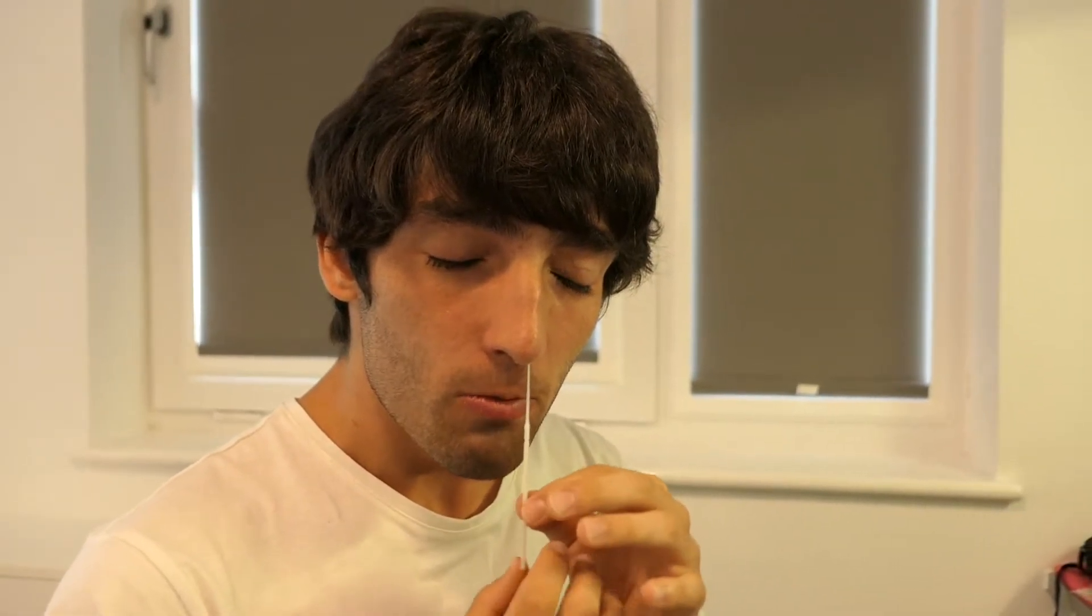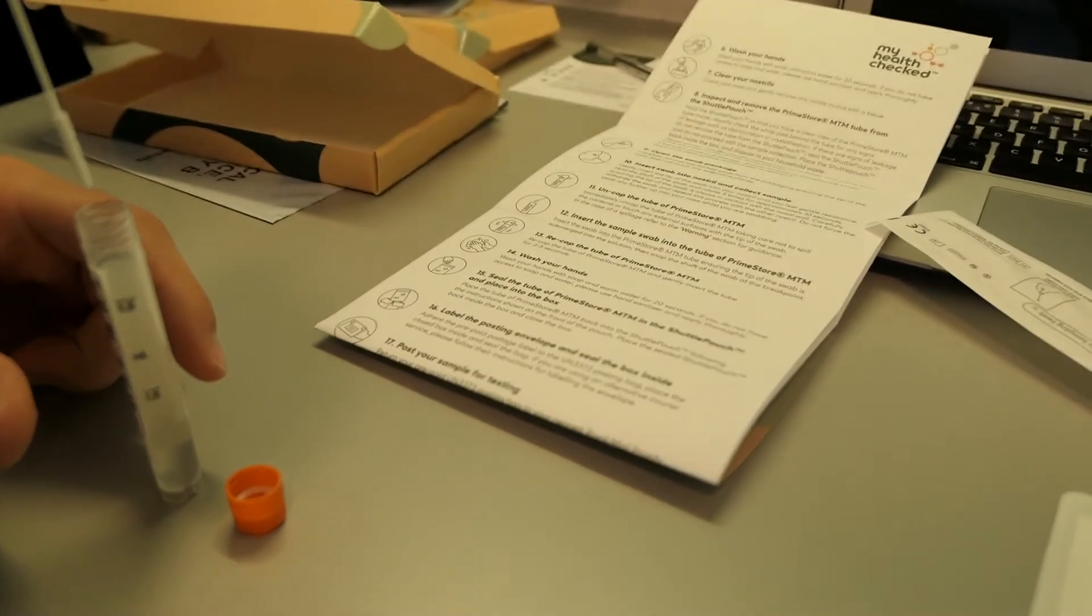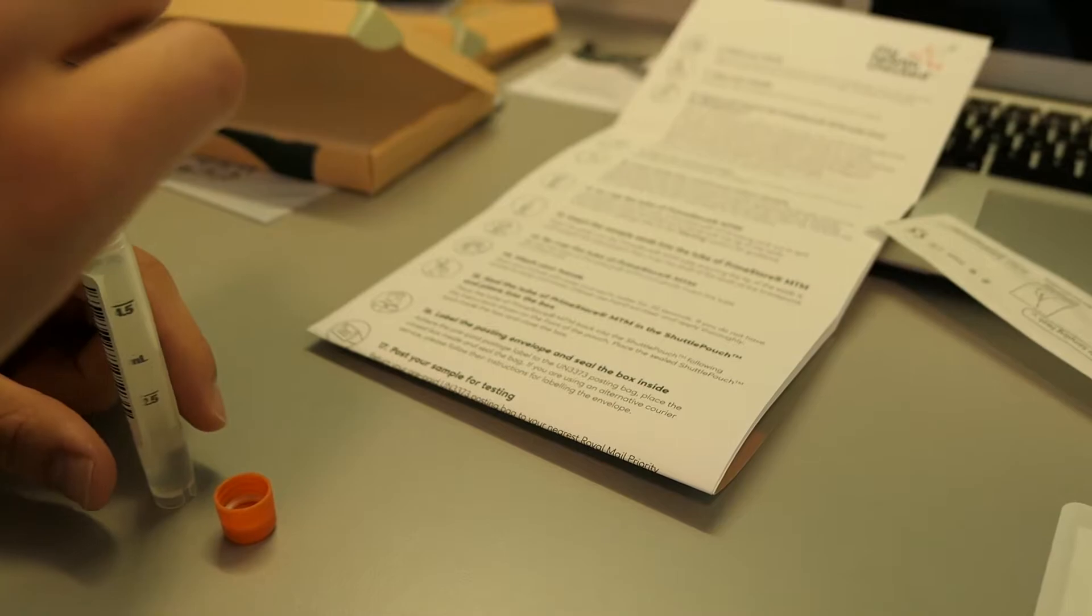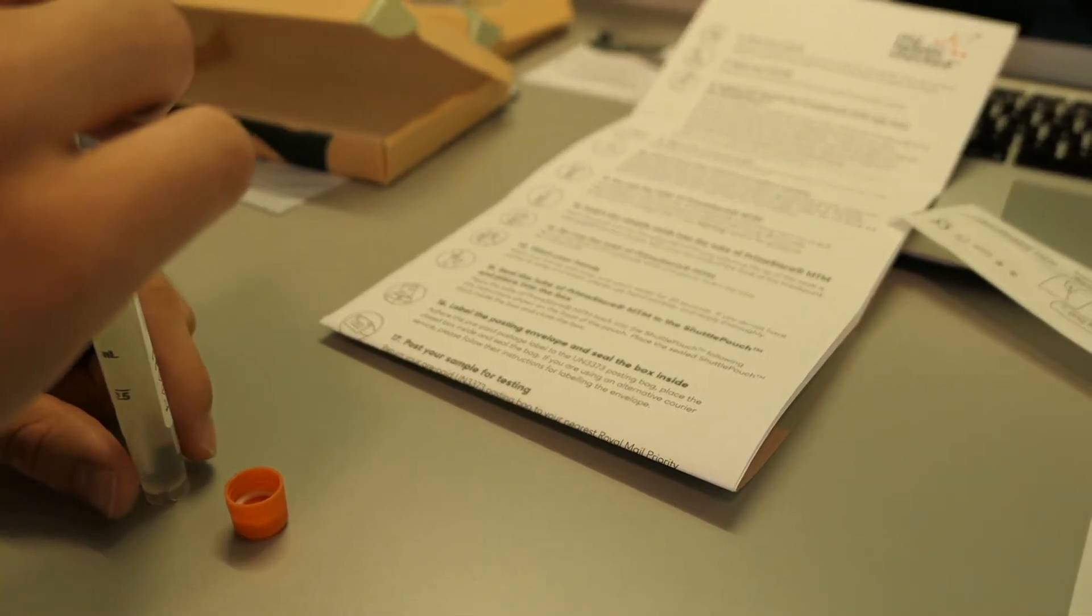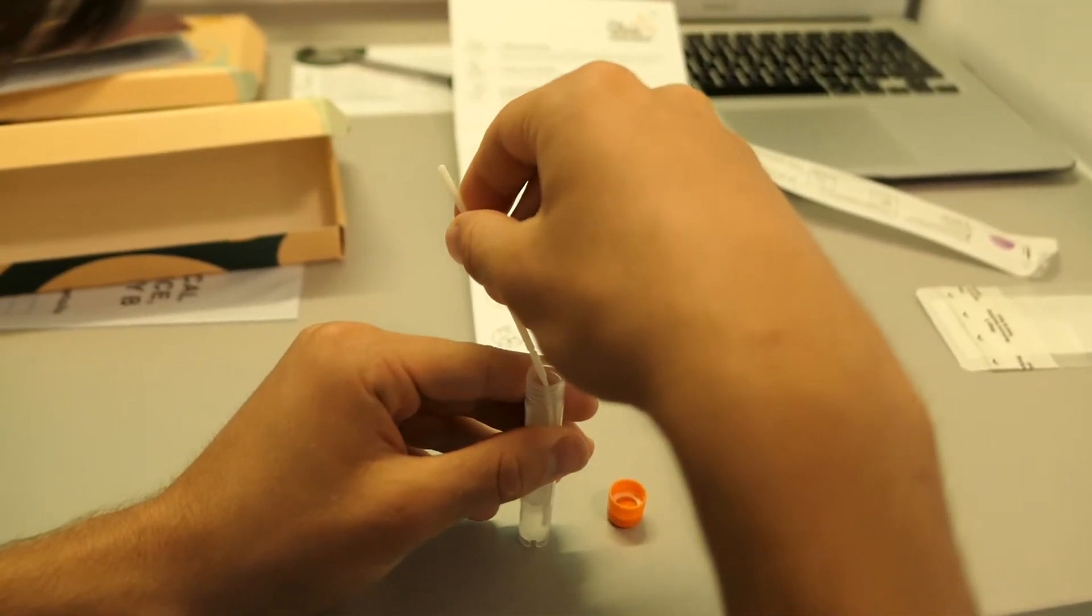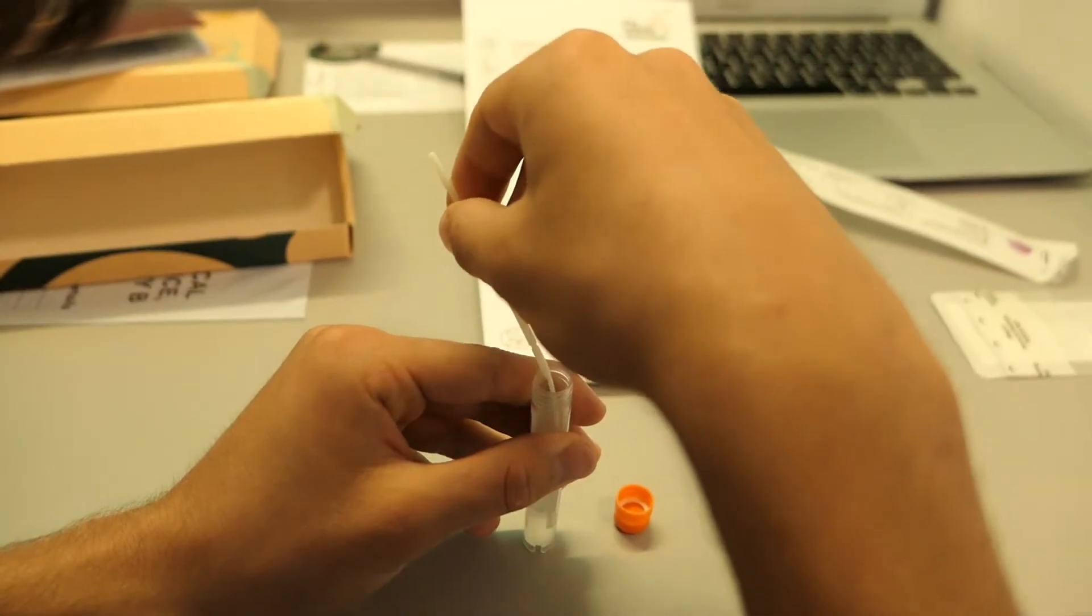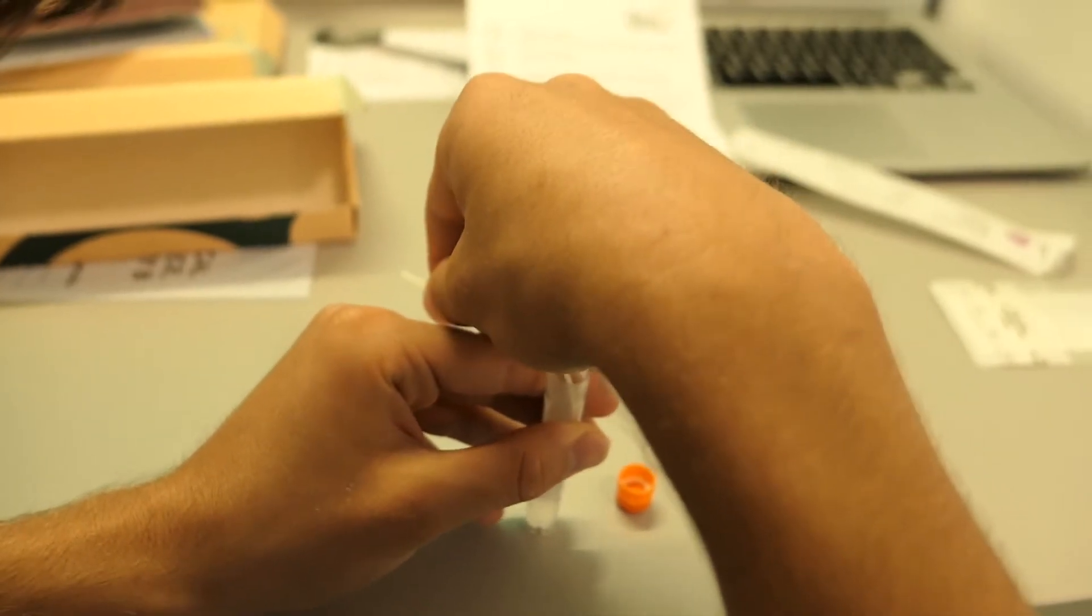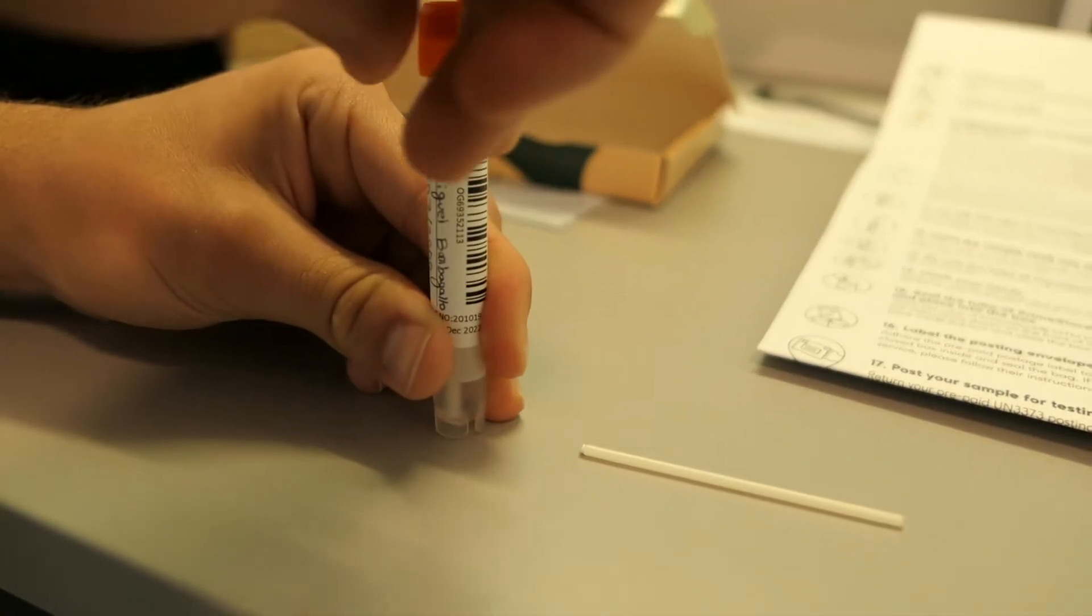Carefully withdraw the swab and repeat this process with the other nostril. Immediately, uncap the tube of Primestore MTM, taking care not to spill the contents or touch any external surfaces with the tip of the swab. Insert the swab into the tube, ensuring the tip of the swab is submerged into the solution and then snap the shaft of the swab at the break point.